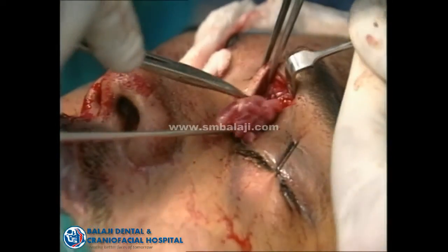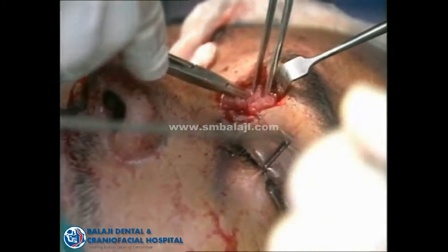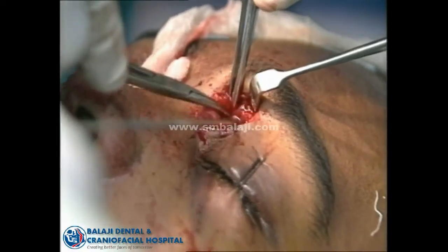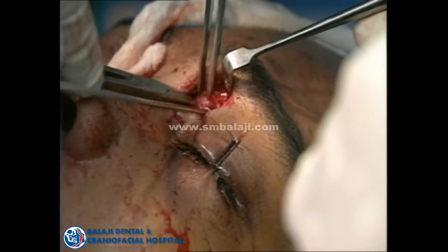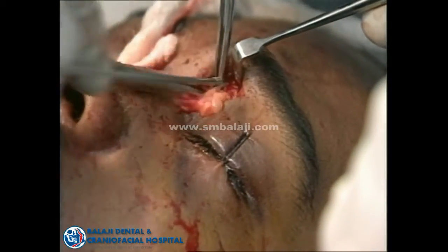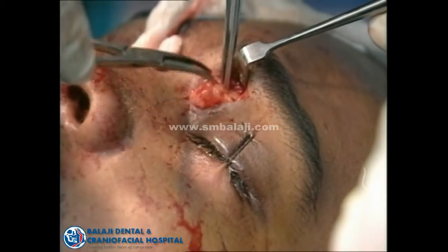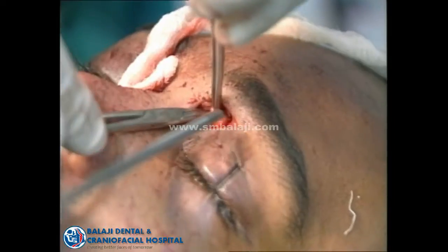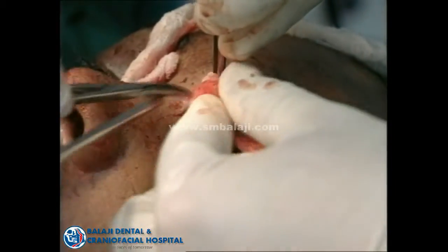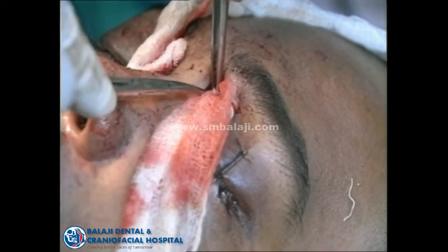You can see me packing the sinus with some part of muscle and whatever fat and fascia I have harvested — it will be packed nicely and closed. This stops the pressure inside completely and the CSF leak stops completely.